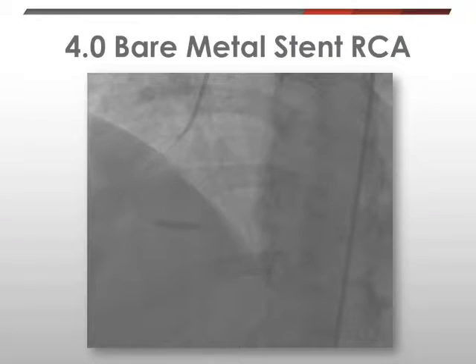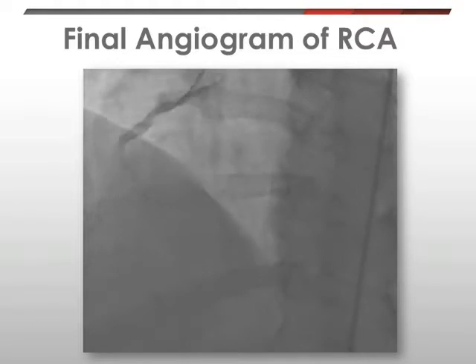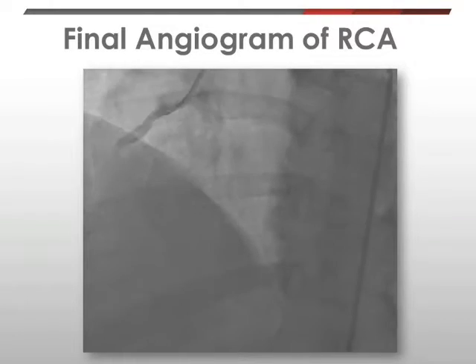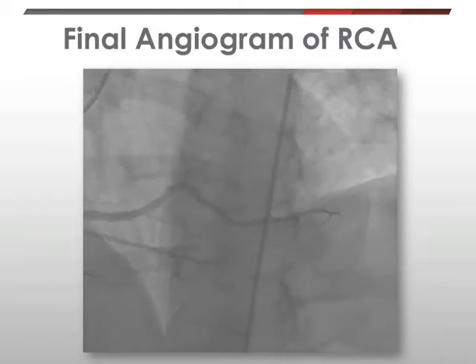I therefore proceeded with percutaneous revascularization of our culprit distal right coronary artery lesion with placement of a single 4.0 bare metal stent, achieving a nice result as shown here.